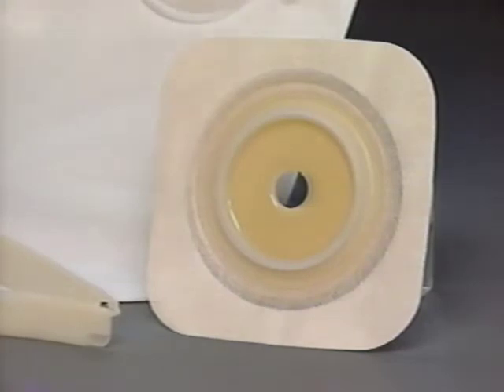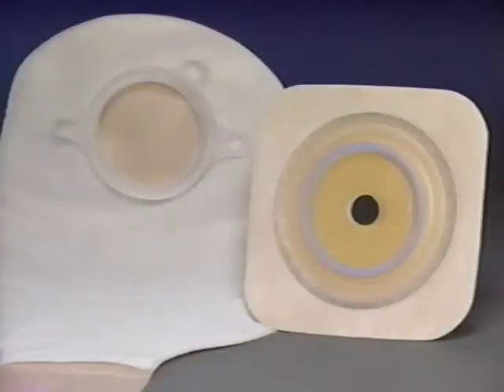This is a Convatec wafer. For reference, this is the part of your wafer known as the flange. The pouch has a matching flange. Turning the wafer over, you'll see the tape collar on top.